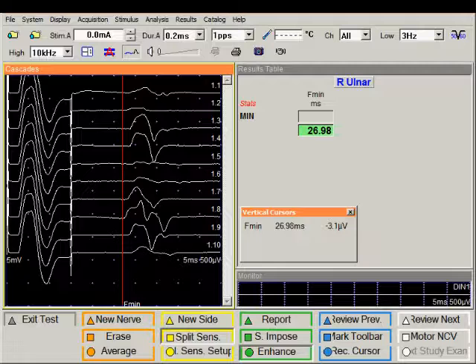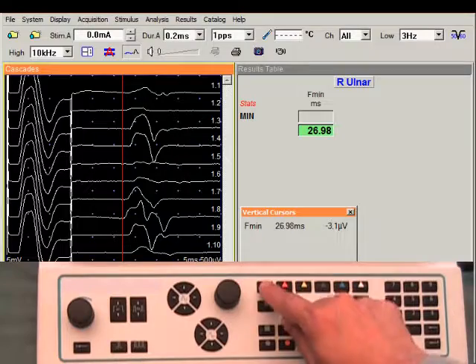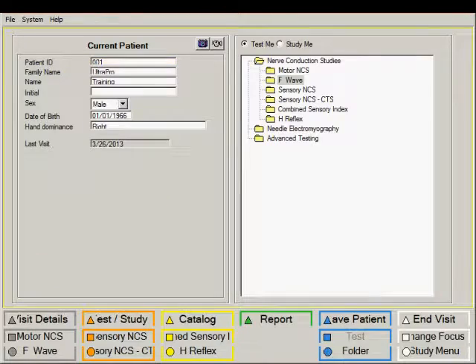When you're satisfied with your results, press exit test to save the data and to return you to the test selection screen.